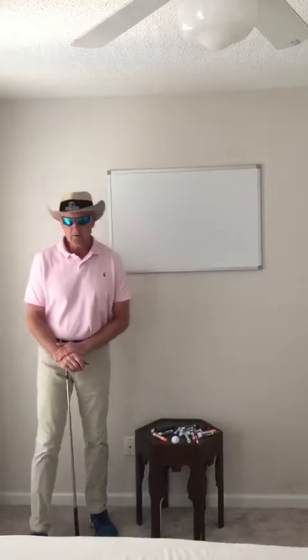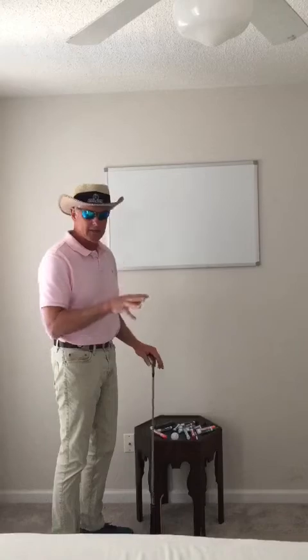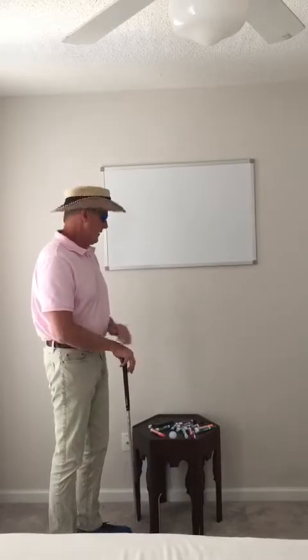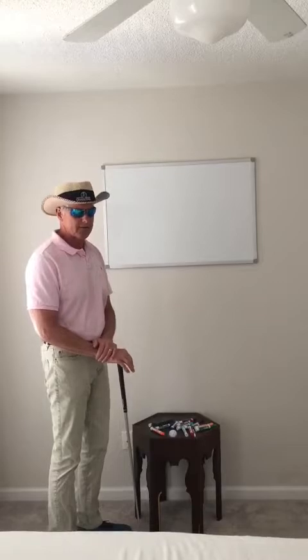All right, so we're going to start with the basics. Knowing that you understand some of the heart physiology and depolarization process, we're going to miss some of it or skip some of it. But I'm going to start at the very beginning so that you can get the most out of this EKG teaching.